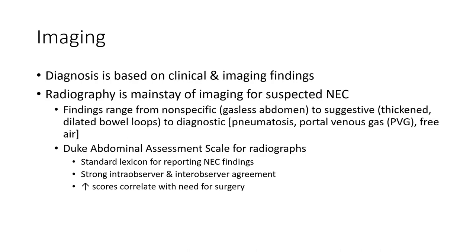In imaging, diagnosis is based on clinical and imaging findings. Radiography is the mainstay of imaging for suspected NEC. Findings range from non-specific to suggestive to diagnostic. For non-specific, we can see a gasless abdomen. For suggestive, we can see a fixed dilated bowel loop. For diagnostic, we can see pneumatosis, portal venous gas, and free air.